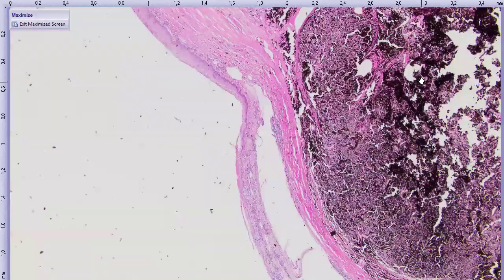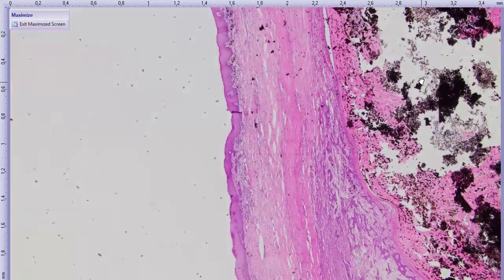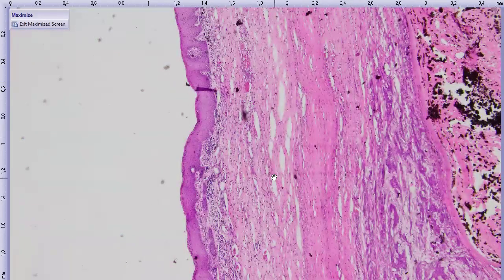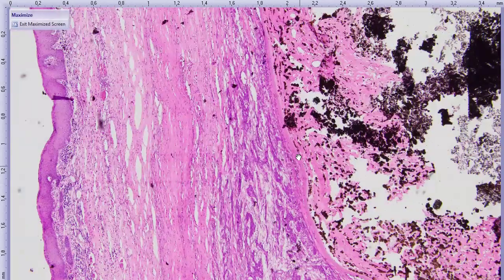Eyelids, to find ourselves. Okay, so just to confirm, this is the ocular surface, so corneal epithelium. Some corneal stroma markedly infiltrated by inflammatory cells, fibrosis, and all this other stuff. And then we have Descemet's membrane right there.